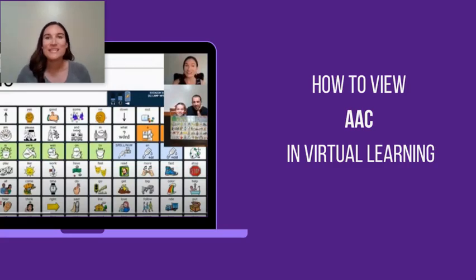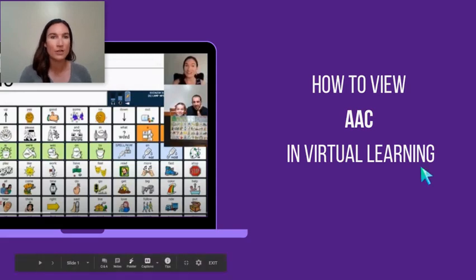Hi everyone! This video is for AAC users or for family members or for support people, whoever is logging into a virtual meeting platform for teletherapy, virtual learning, whatever it might be. And we're going to talk about how you can get a second camera angle so that we can see your face, and then also a camera that goes onto the AAC system.